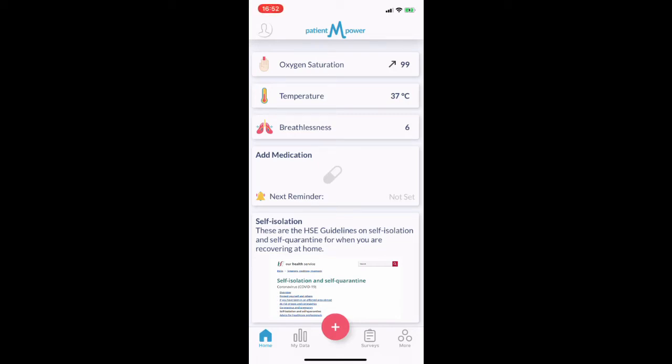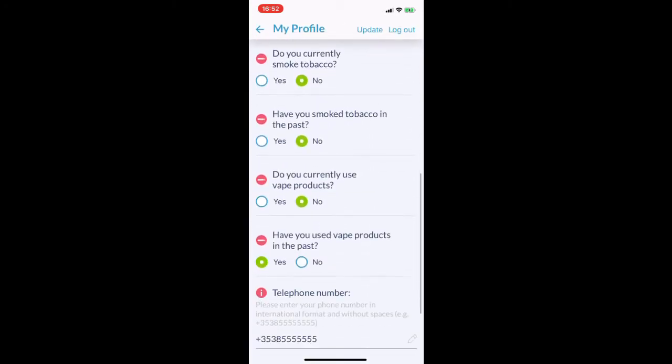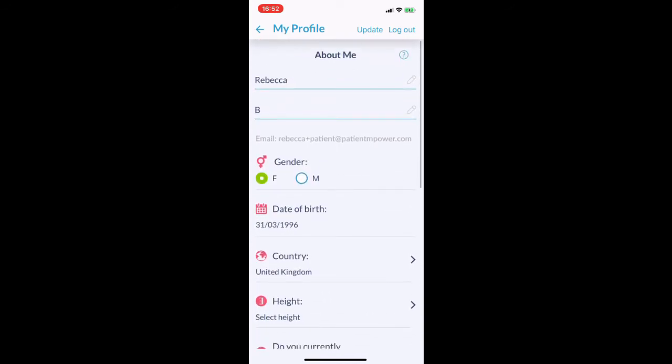There are a number of measurements we are looking for you to take using the app. Before taking the measurement, please take time to fill out the profile information. This can be found by selecting the outline of the person in the upper left hand corner of the screen. Once it's filled in, press update.